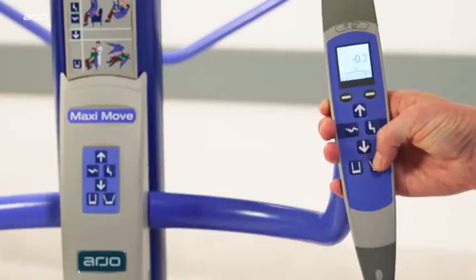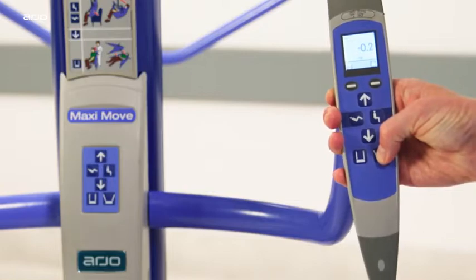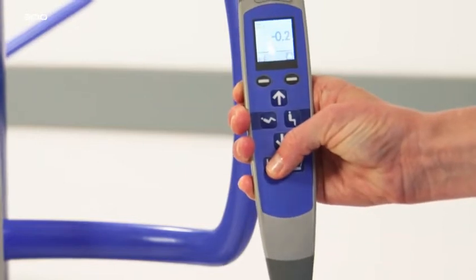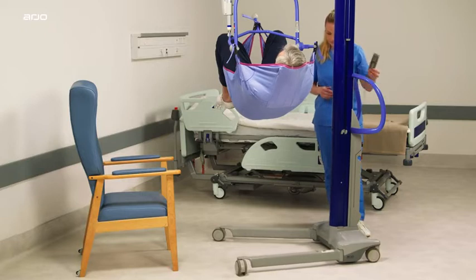Opening and closing the chassis legs: push the legs open button on the control handset or control panel until the required width for the chassis legs is reached. To close, press the legs closed button. Movement will stop if the button is released, whether opening or closing.